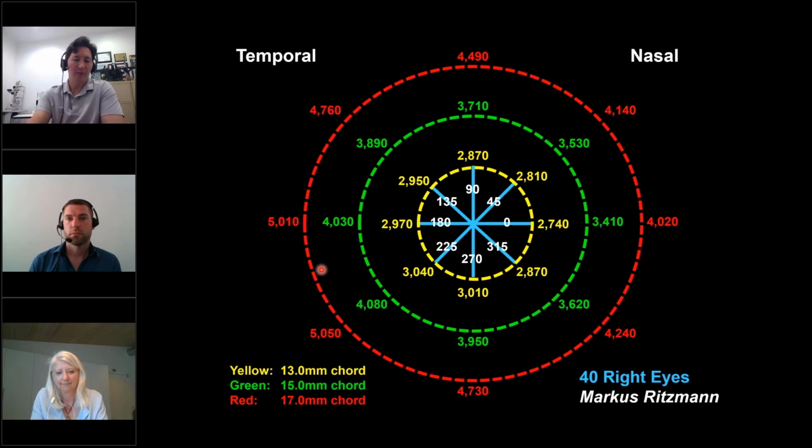And maybe assuming that a scleral lens may ideally center is not something that we can presume is likely for most eyes. Certainly it does happen, but for most eyes, we shouldn't expect that. So the highest elevations are nasal superior through this quadrant here, and that may be pushing the lens toward the lowest elevations, which tend to be temporal inferior. And then we also have lid force and gravity that plays a role as well.